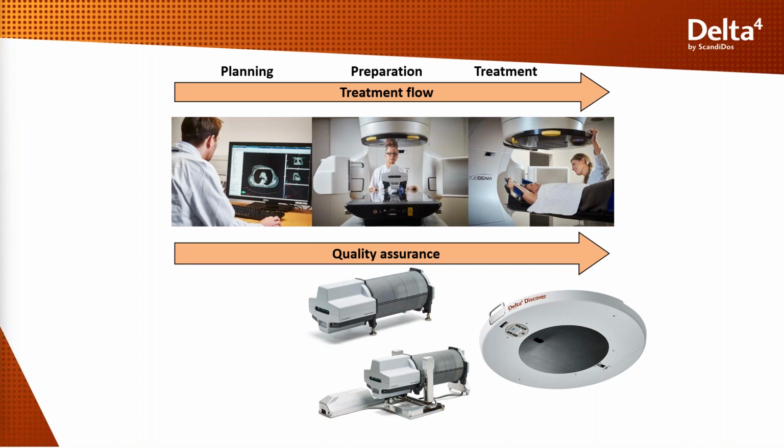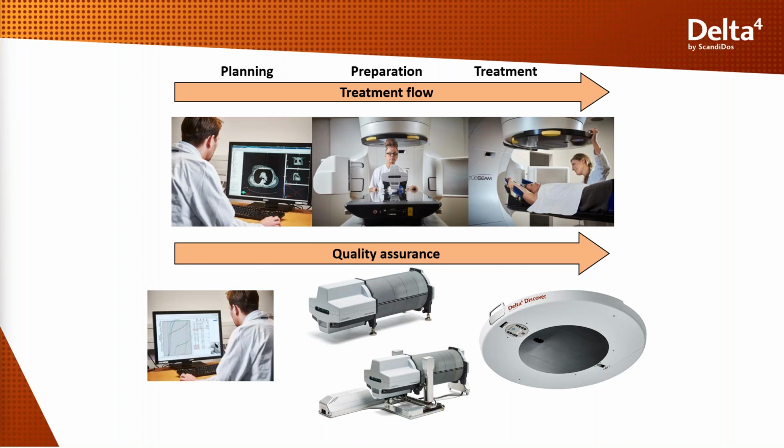But what about the dose that you have agreed to treating the patient with? So to complete the full QA program in your clinic to validate also the dose generated on the patient, you need a secondary dose calculation. And of course, we want to offer you Delta4 Insight for this purpose.